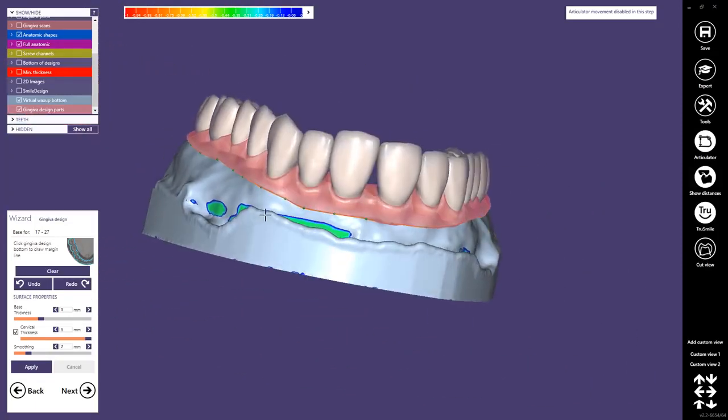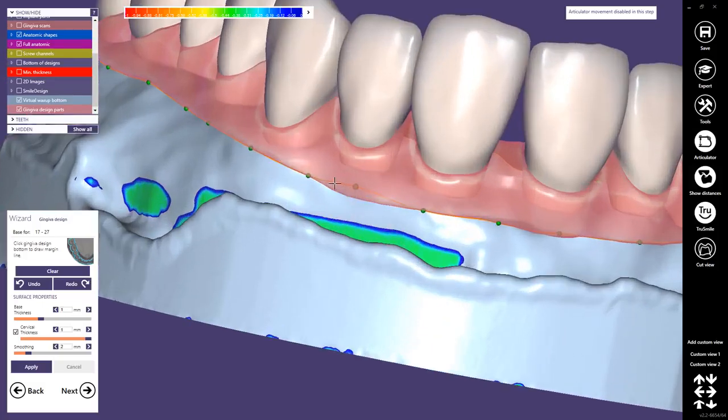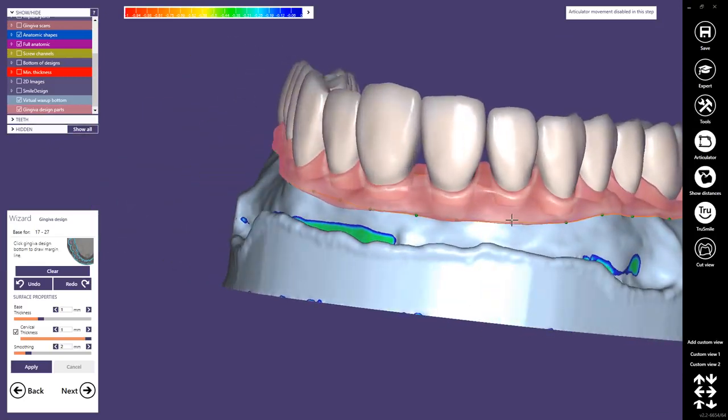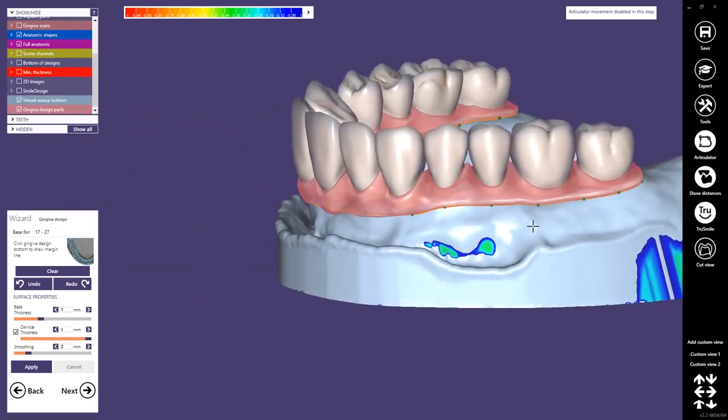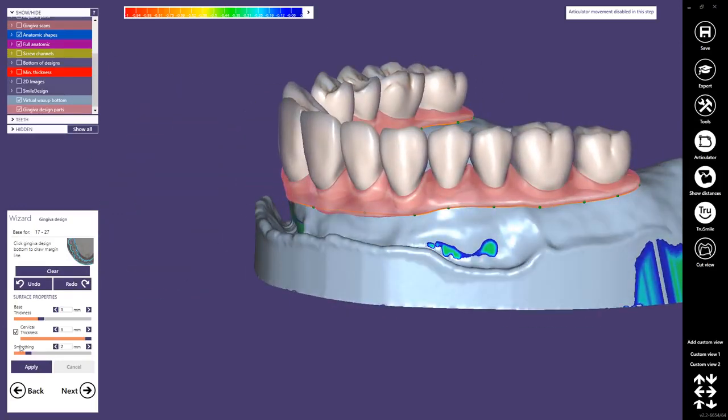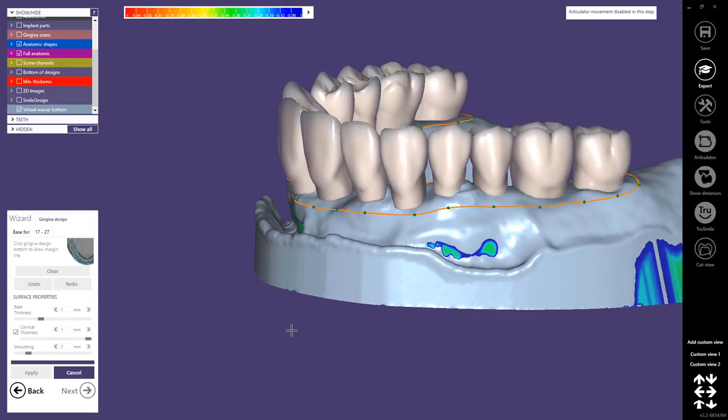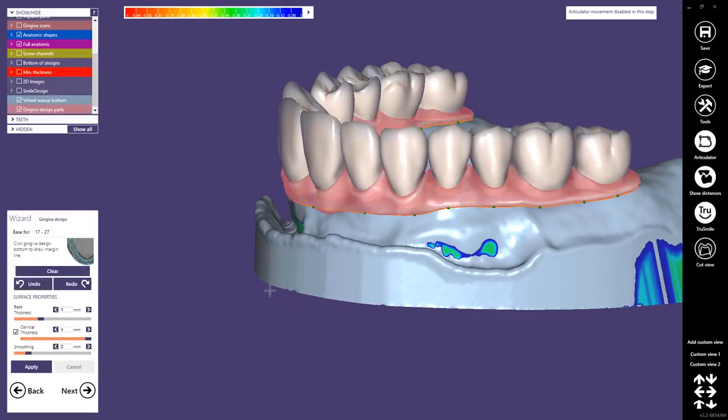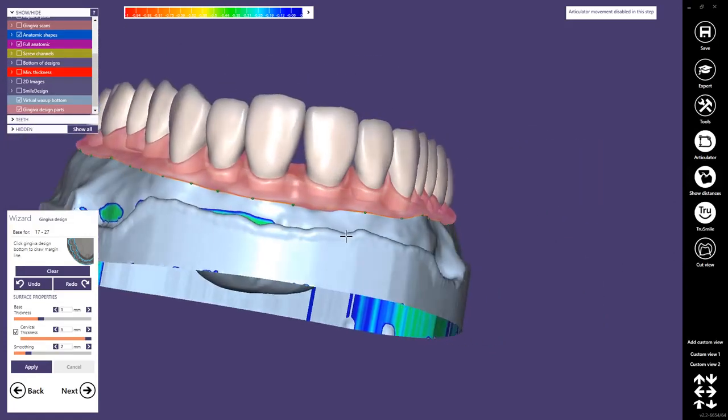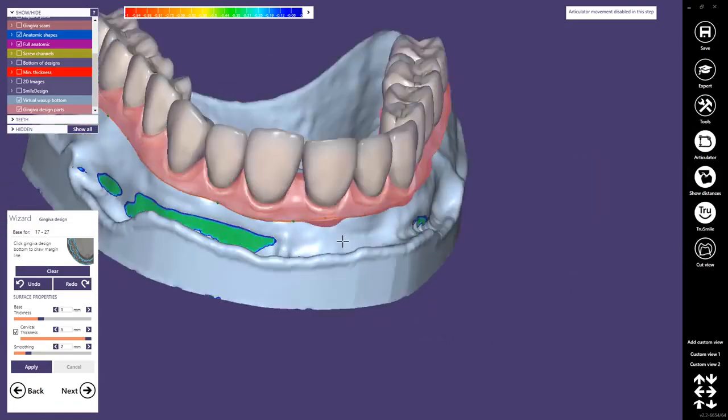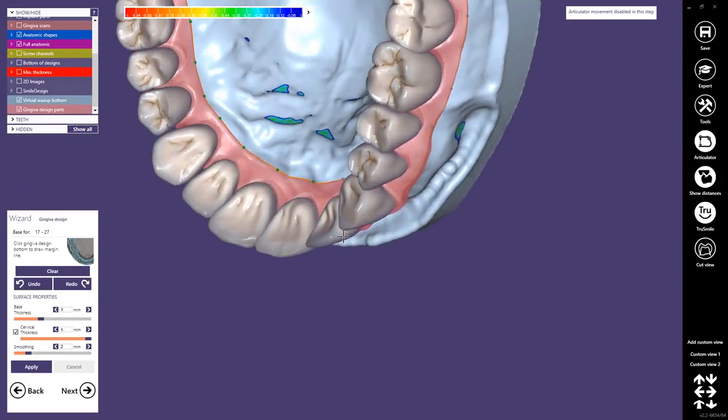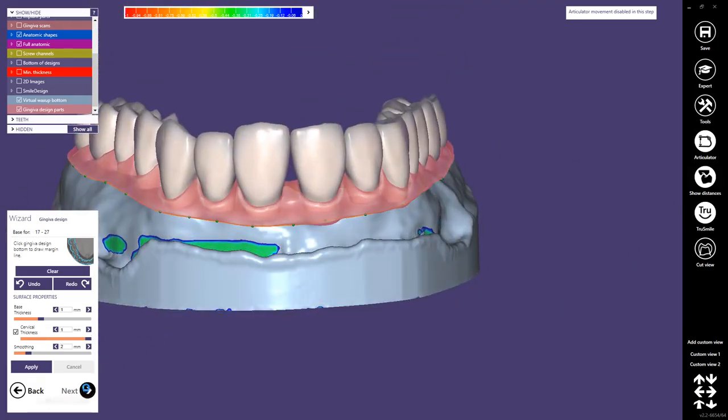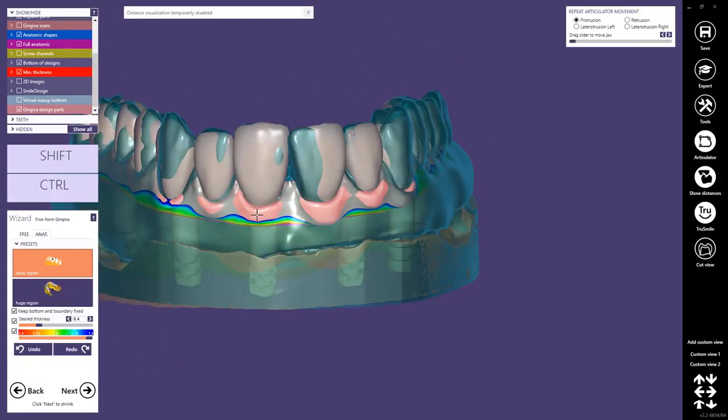We can still adjust it and recompute again to make it here as short as possible.